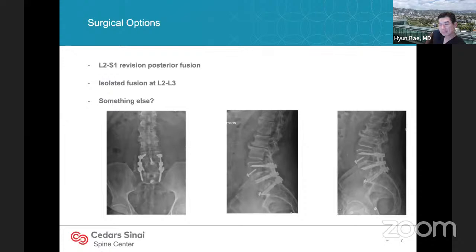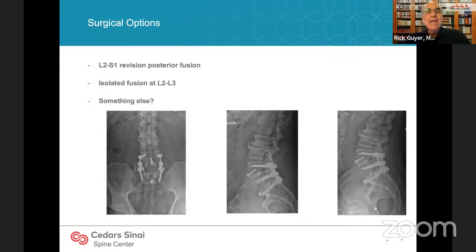You know, he does have some anterior spurs. I didn't look closely at the axial, but this would be somebody you might consider a disc replacement. I can't see by the flexion extension how much instability. He just had a little widening of the one facet. But as you said, if you add another fusion, then this guy's 64, in his early 70s, and he's looking at the lower thoracic all the way down.